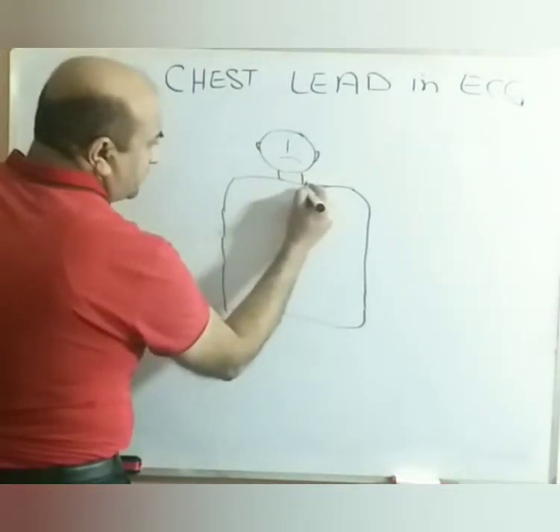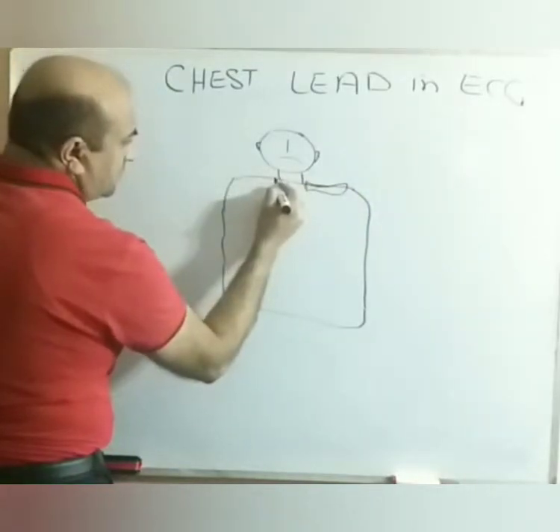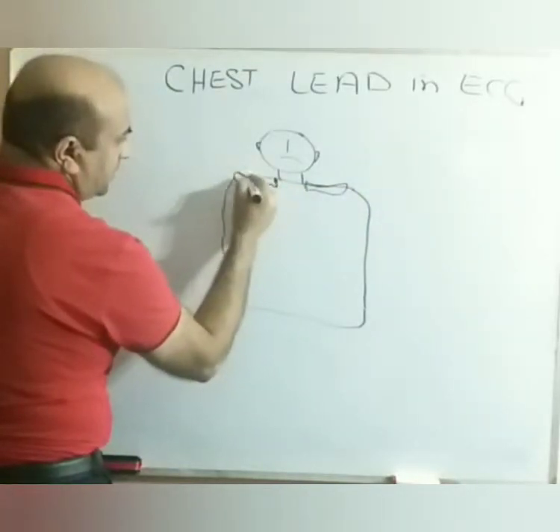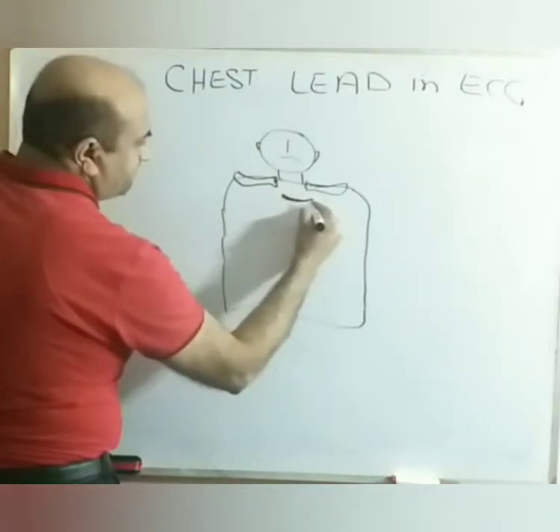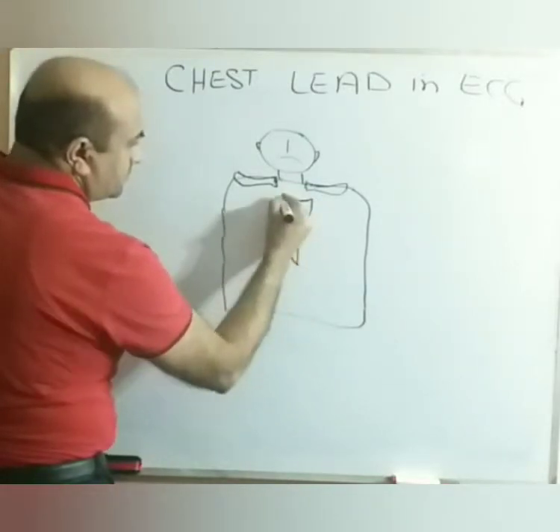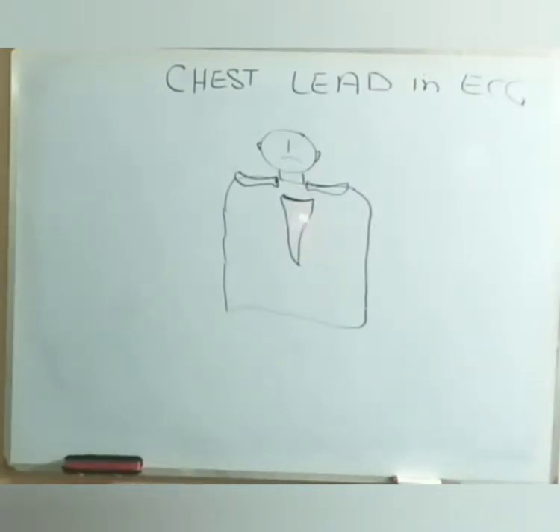This is patient clavicle. This is sternum of the patient. These are two clavicles. And in the center we have this sternum. This is a suprasternal notch here.